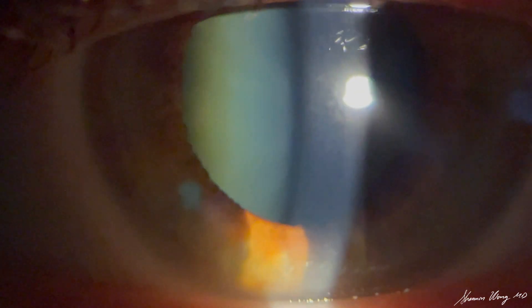Looking at his left eye, we notice a similar degree of phacodenesis to the right eye. We ask the patient some questions during his post-op day one exam. The surgeon explains that the lens is in place and slightly off-center, but the center of the lens is within the pupil.